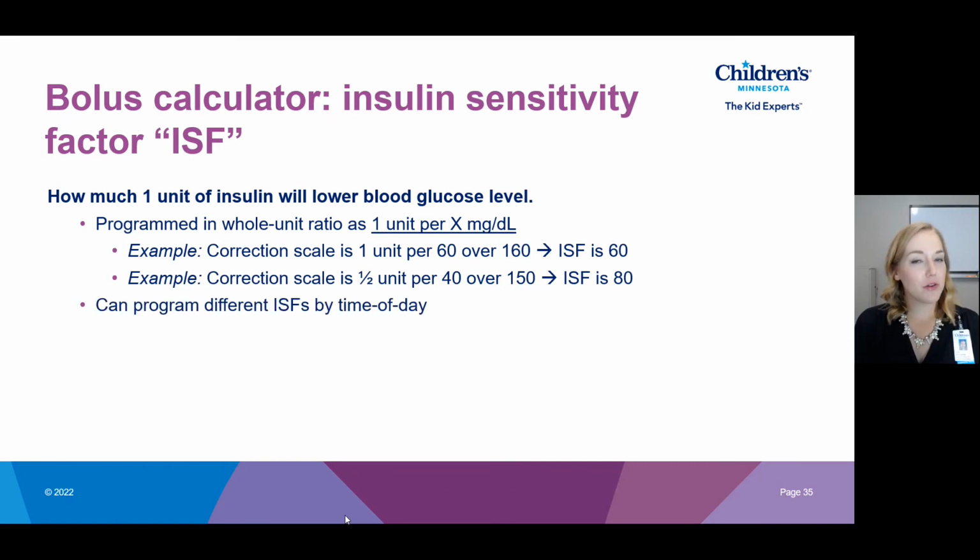You can also program different ISFs by time of day. A lot of people find they're more sensitive or more resistant to insulin daytime versus nighttime. So again, you can program it by time of day so that you don't have to think about it. The pump is keeping track.